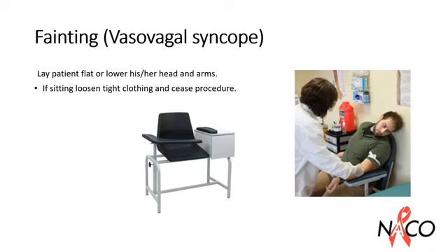re-emphasized. Such events also increase the risk of needle stick injury due to unexpected movement of the patient and panic response. Needle should be removed carefully. Important to seek help from other healthcare worker.